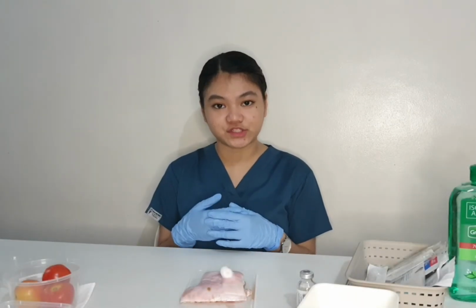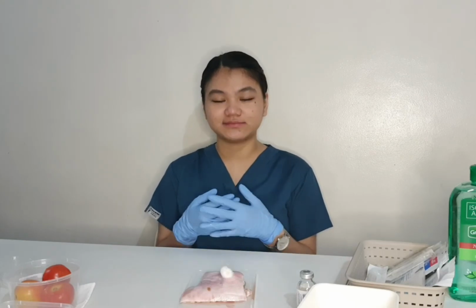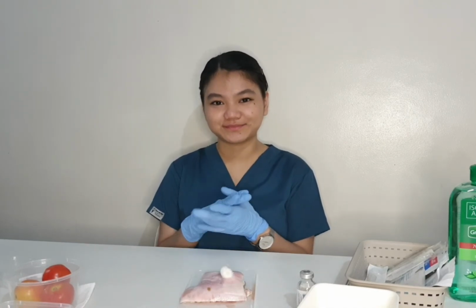Make sure that you put the patient in a comfortable position. It's either Fowler's position or a supine position. It depends on the patient's condition and on how you need to administer the injection. So we are now done doing the 3 injections, the intradermal, the subcutaneous, and the intramuscular injection.